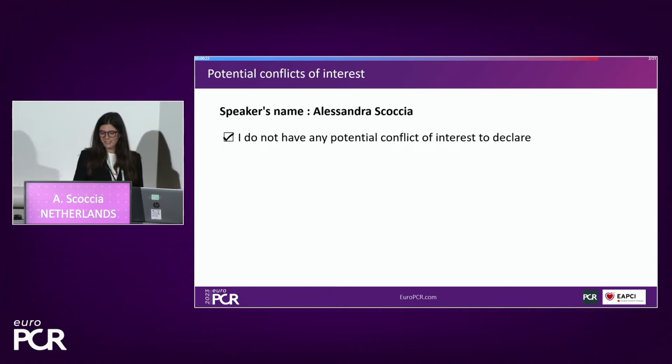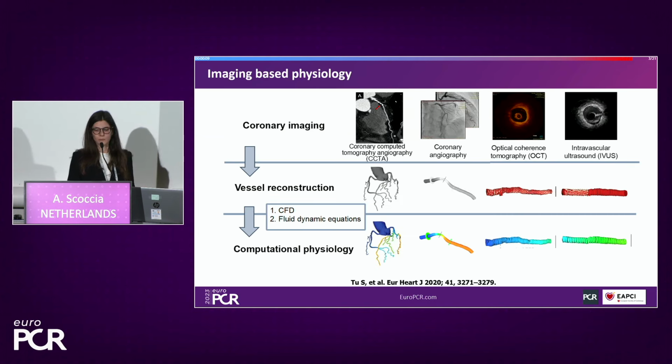Thank you. Perfect. Just before presenting the clinical case, I would like to give you a short overview about what is VFFR, about the CAAS software, and which are the clinical scenarios in which VFFR has been validated. So, VFFR is a software to derive FFR based on a 3D QCA.